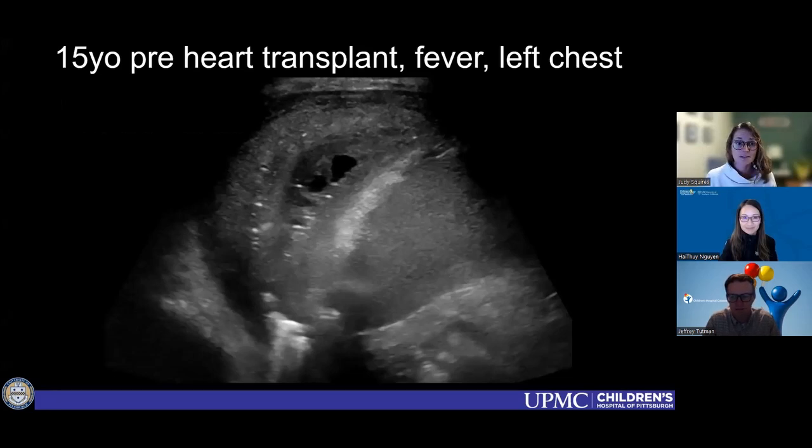If it's just atelectasis, he gets a heart. So it's you that's going to decide, basically. And I'm like, oh God, no pressure.